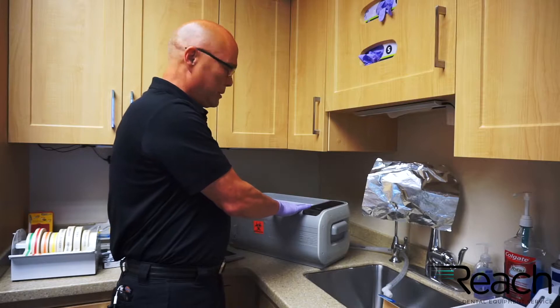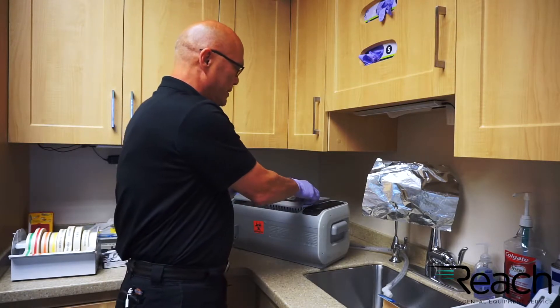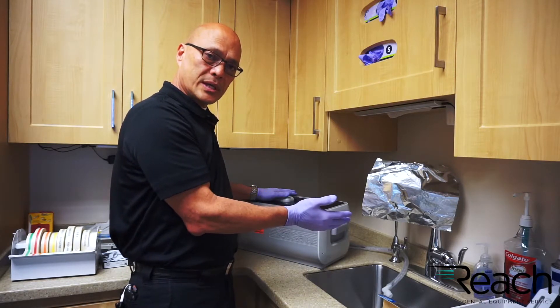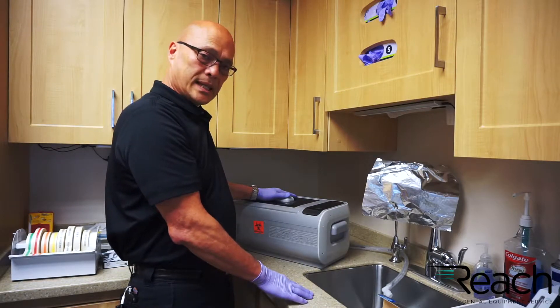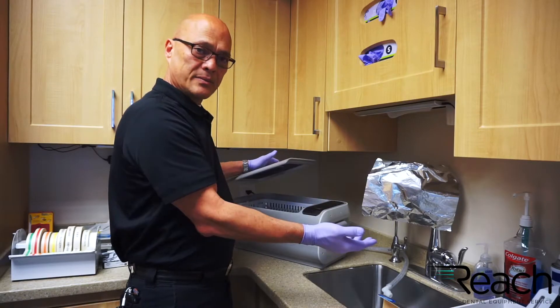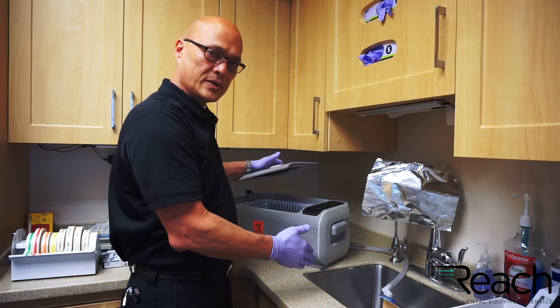Put a basket in place, put your instruments in, put the lid on and select a time. Follow the manufacturer's recommendation as far as the time and start. Once it's done, take the instruments out, rinse them off, let them dry, wrap them, and follow whatever the procedure is in your office.